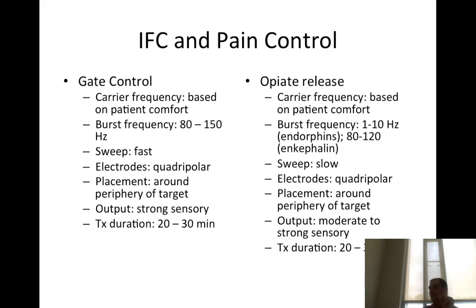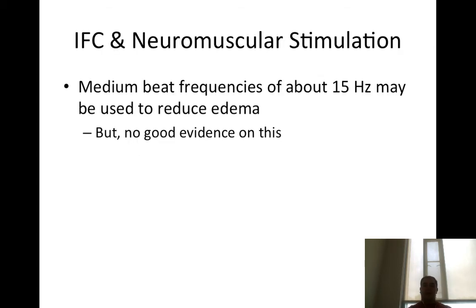So let's back up real quick. I don't think I've mentioned this. Why do you think that when you play with the machines, you'll see all machines are set for 15 minutes? It's insurance companies. Insurance companies got with the manufacturers of these electrical modalities and set all the presets to 15 minutes when you turn the machine on, because insurance will reimburse the physical therapist per 15 minutes of use for that modality. So if you do 10 minutes of use of that modality, they can't get reimbursed for that. 15 minutes, though, they can. It's crazy. Insurance world. Okay.